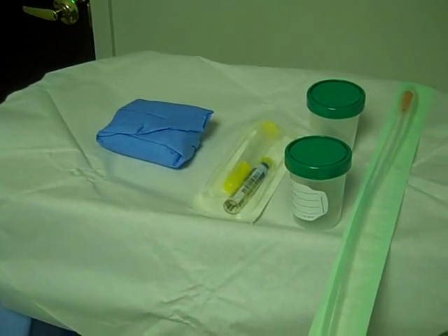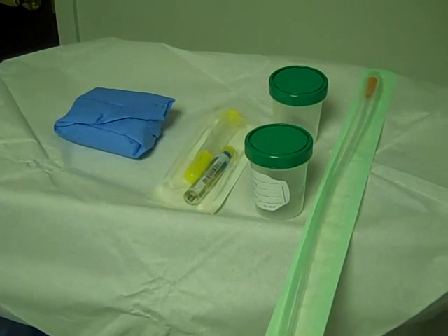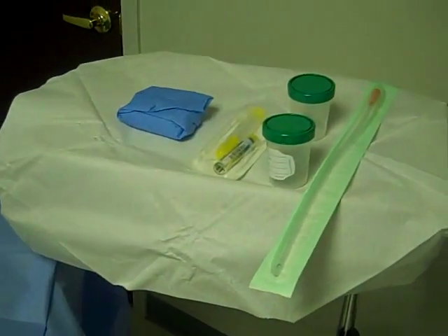Obviously this drape does not need to be sterile, but everything that gets opened sterilely goes onto this sterile field. Alright, thanks.